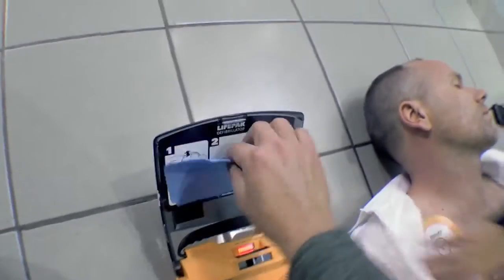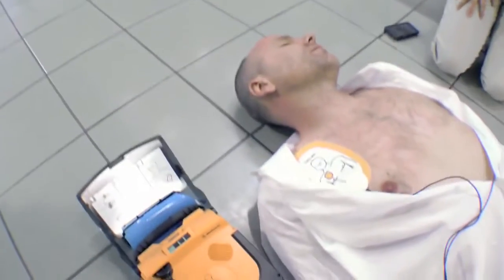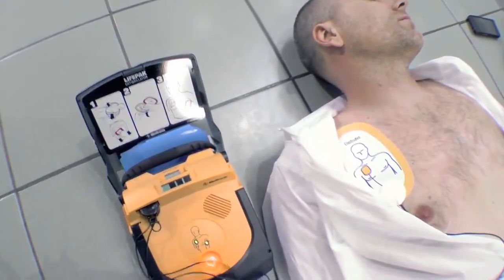Do not touch patient. Evaluating heart rhythm. Stand by. Preparing to shock. Everyone clear. Press flashing button.